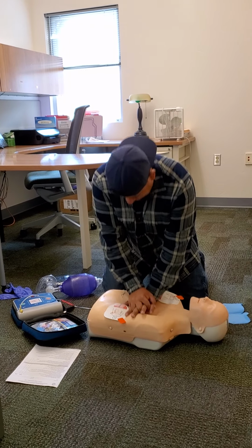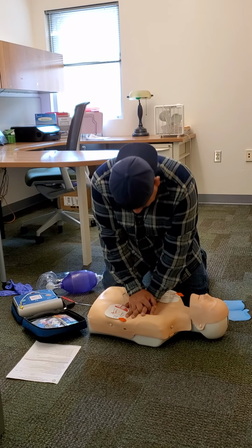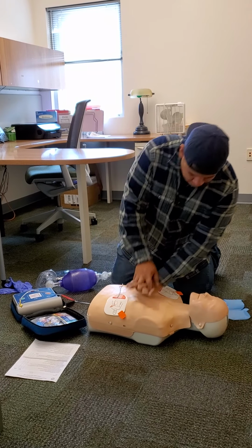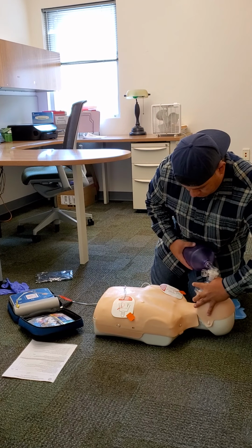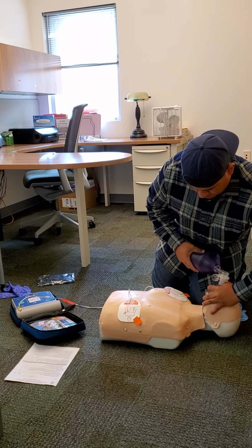So then we would begin another 2-minute cycle of 30 compressions to 2 ventilations. The AED is going to remain on, and it will analyze about every 2 minutes. And that is the end of your cardiac arrest management with AED skill sheet.